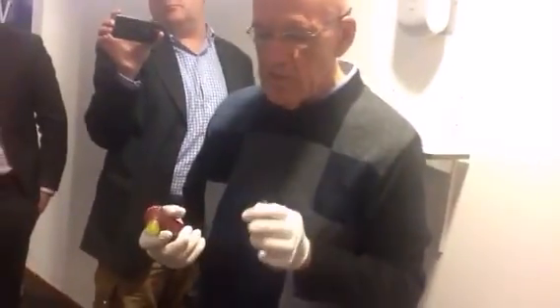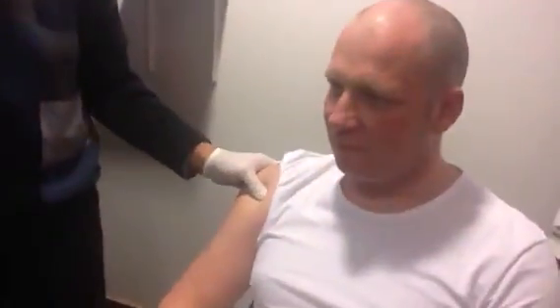Now that's sterile at this point, so just to double-check where we are — I can feel the surgical neck right there, and right there, there's the spot. So are you ready, sir? I'm ready. Okay, so we'll go right in here at this angle.